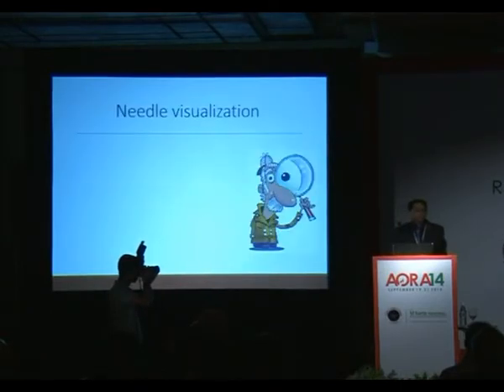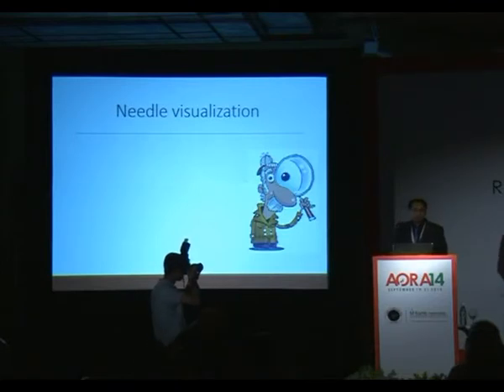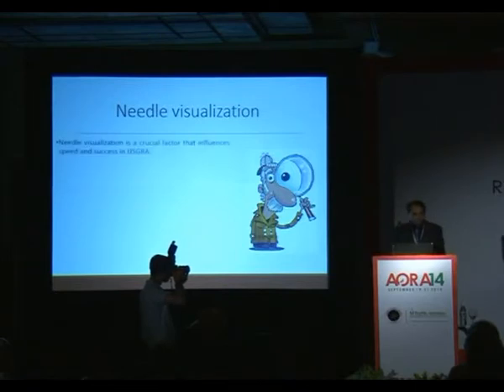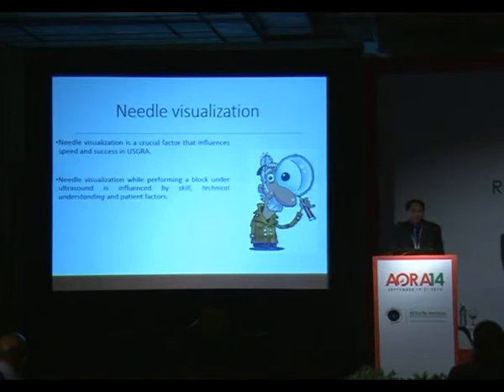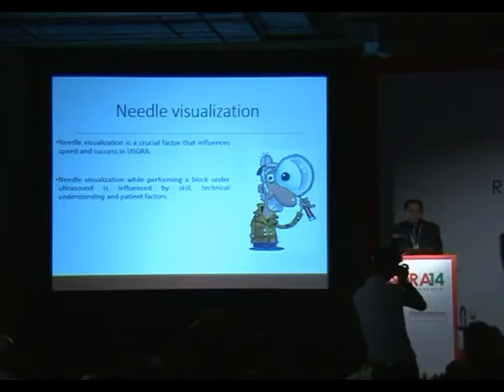Right, how many of you do ultrasound guided blocks? Can you guys put your hands up? And you all might know that imaging the nerve is one problem, but imaging the needle while you're doing the block is another problem. When you can see the needle very well, and then you can get the block done that way, things look very good. But we also know that you do require a little bit of skill to do this, and a little bit of technical understanding. But even having all the skill in the world, all the knowledge in the world, would put you to shame if you encountered a rather large patient where you have very steep needle angles.